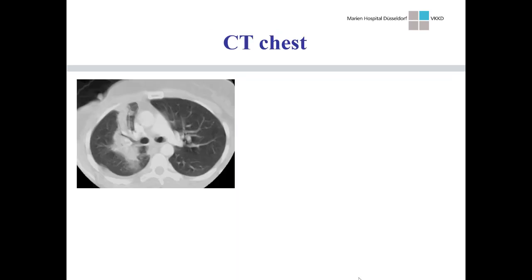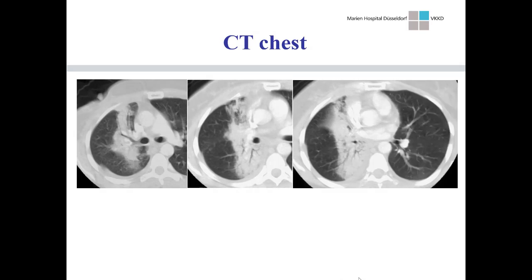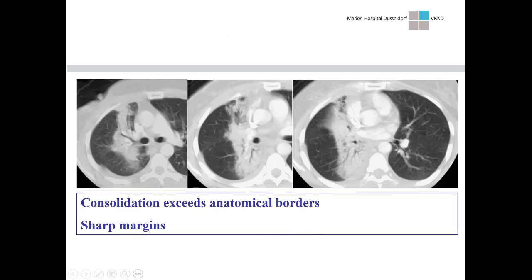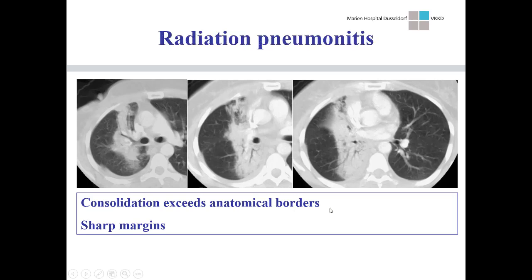We proceeded to a CT scan, and this is a very typical finding. What we see is a consolidation that exceeds anatomical borders — it simply crosses the lobar fissure — but it has relatively sharp margins. Those two are key features for radiation pneumonitis. This makes it very clear the patient does not have pneumonia, and it's very unlikely to represent local recurrence, at least not in a breast cancer patient.